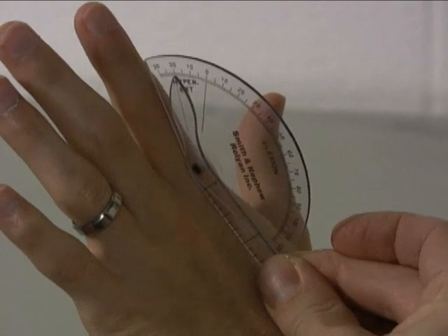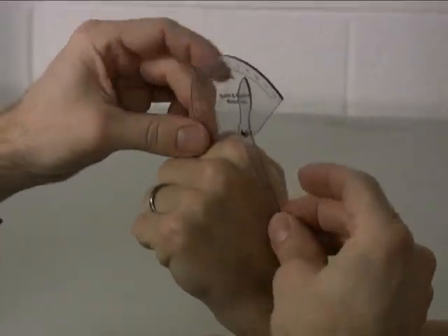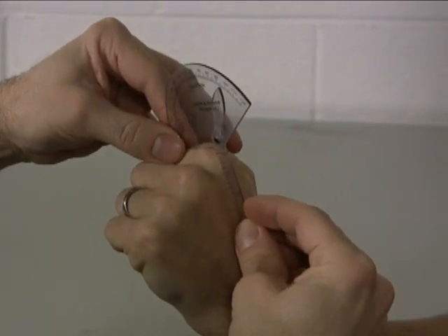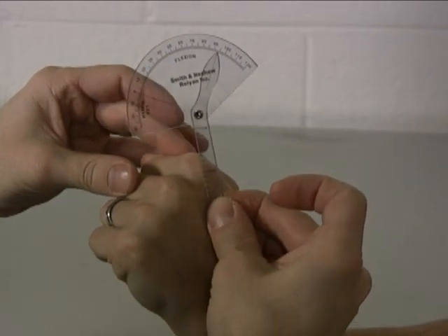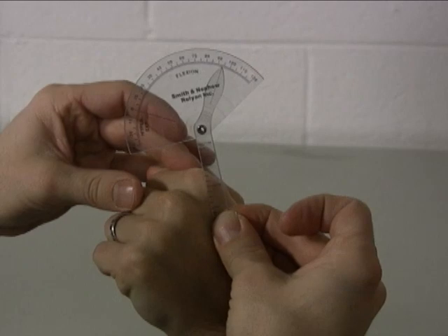And then go ahead and make a full fist for me. Okay, nice tight fist. Good. And we have about, there we go, I'll turn this so you can see, about 95 degrees of MP joint flexion.